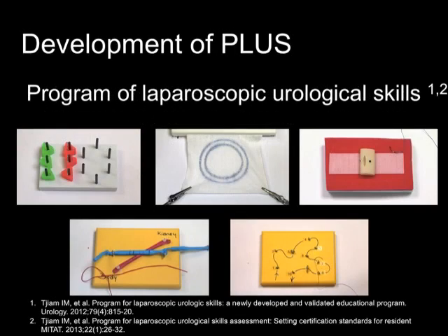Chum et al. developed and validated the program of laparoscopic urological skills on more than 50 novices, intermediates and experts. The program of laparoscopic urological skills offers quality and time standards for completion of five basic laparoscopic tasks.